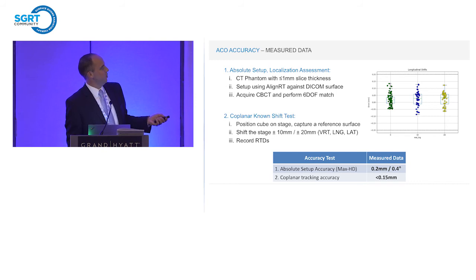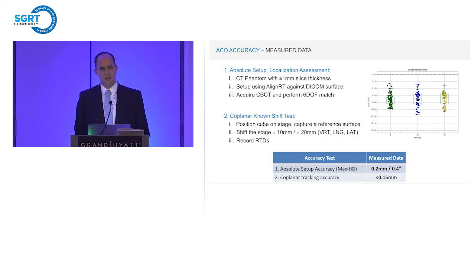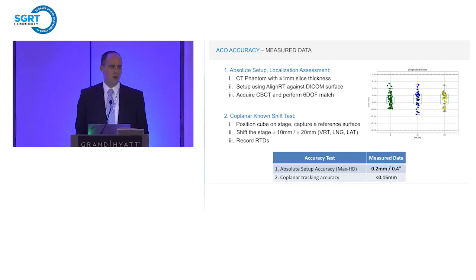So in green, when we have 0 displacement, plus 1 centimeter and plus or minus 2 centimeter shifts, longitudinally, sorry, all of our real-time delta values were within less than 0.15 millimeters of the known phantom position. So for this phantom study, these known shifts in this coplanar setup, we could track this phantom within less than 0.15 millimeters. So again, I think quite impressive.